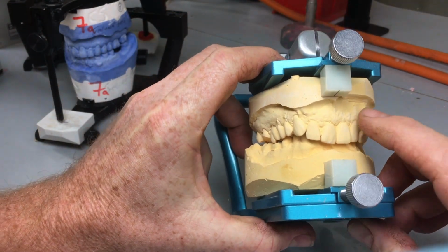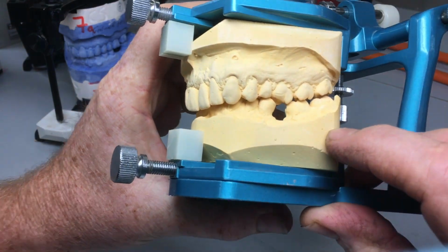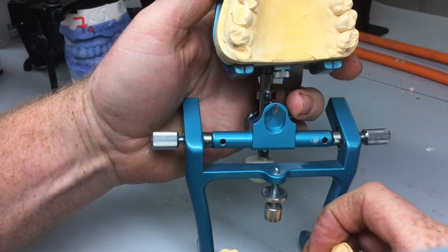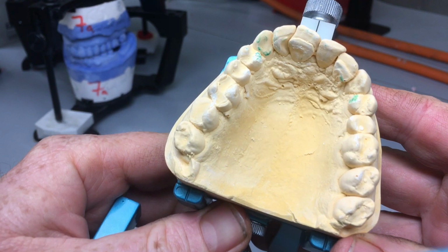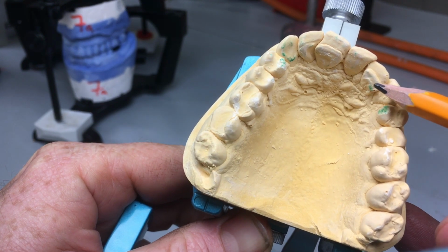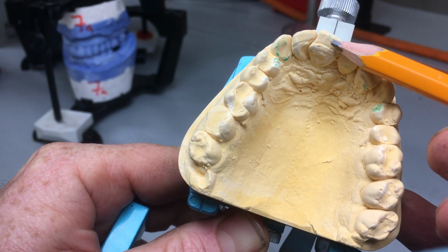Now, to exacerbate this, it looks like at some point one of the teeth has been extracted and has had an implant put in that place. So, in that scenario, I imagine that might have happened because maybe there's been constant failure of veneer, maybe a root fracture, something like that. But the implant has been placed in the new position of the teeth where the veneers are now. So much more anterior to where the natural teeth are.